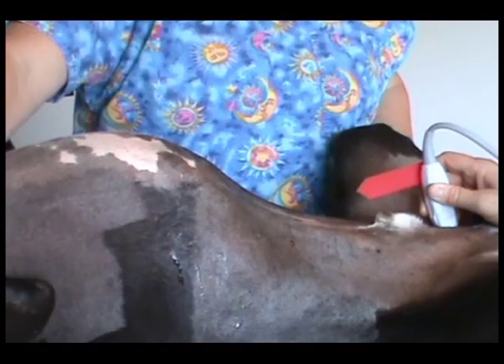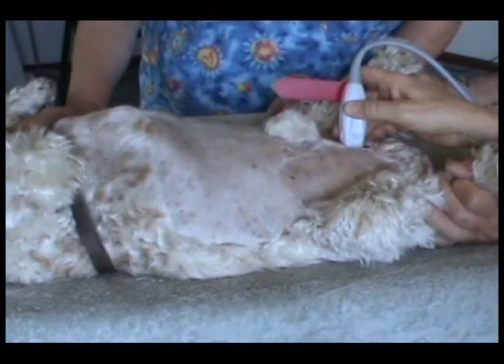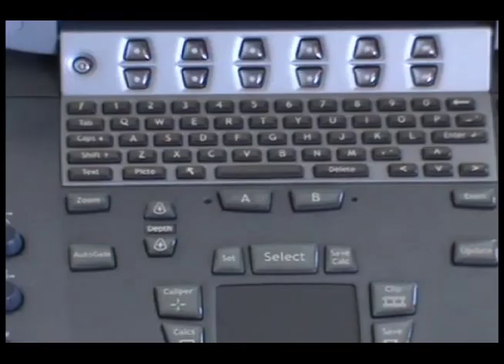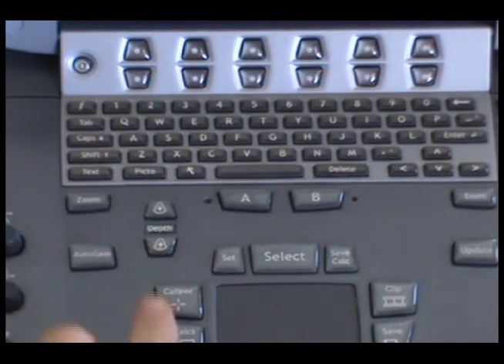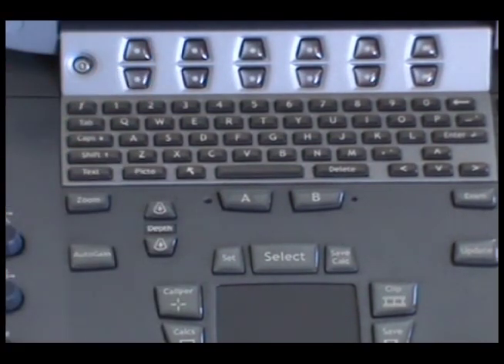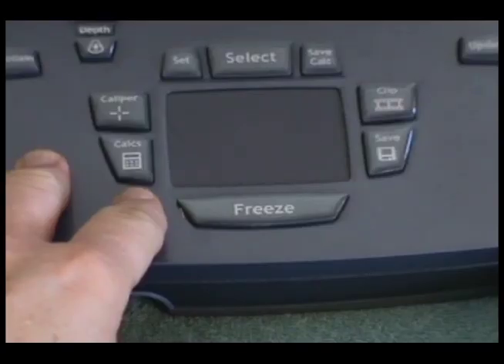Remember to keep the organ centered on the ultrasound screen to reduce artifact. With the prostate, it is often necessary to angle the transducer caudally to look under the pelvis. Adjust depth to fill the ultrasound screen with the organ of interest. If needed, adjust transducer frequency for the current depth. Adjust gain for the best image. And adjust focal points to the bottom of the organ of interest.